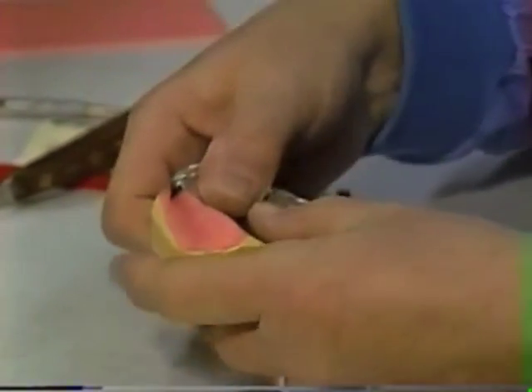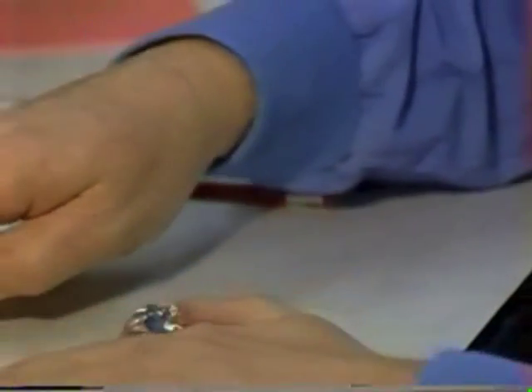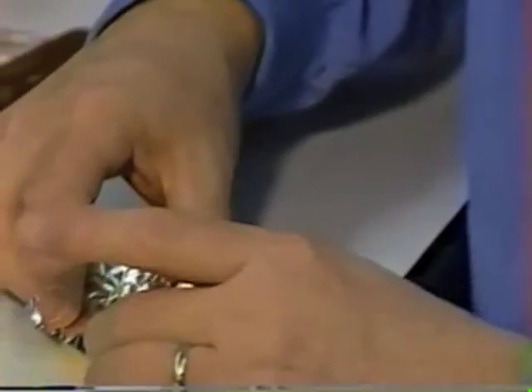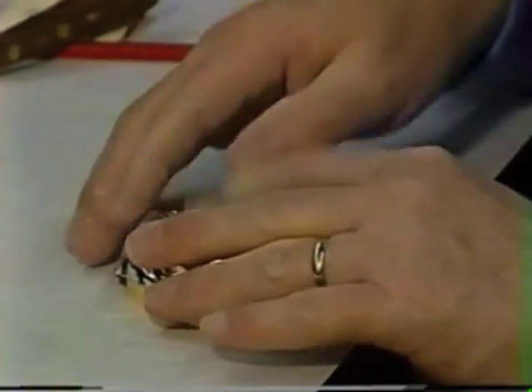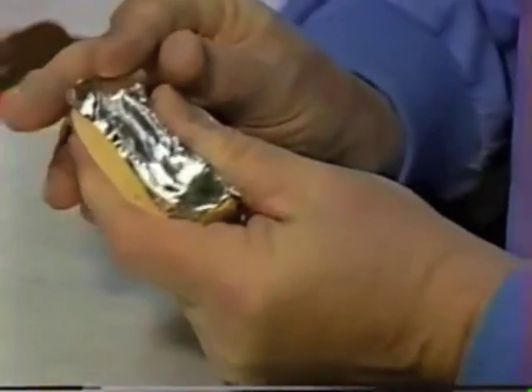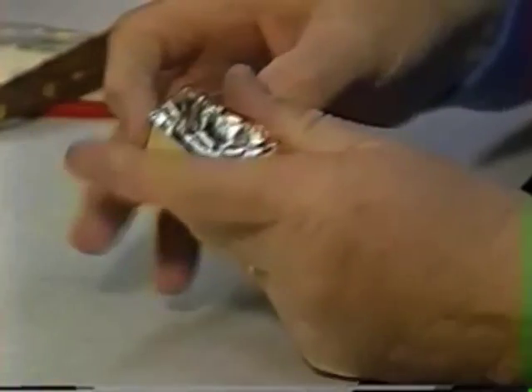And then we can take the other half of it, and it can overlap that original piece that we have. Take the other layer of the tin foil and let it overlap. There we go. And we adapt it in and rub it into it real well to sort of burnish it to the cast.